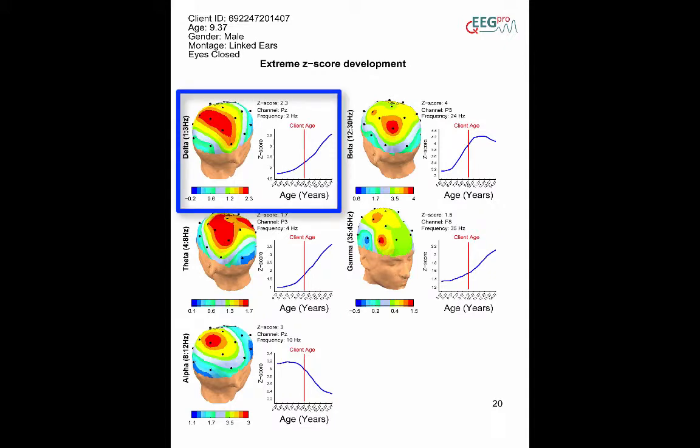Let's focus on the upper left corner of the example page. Here we see a three-dimensional plot which shows the most extreme z-score within the delta band. In this example, the most extreme z-score within the delta band is 2.3 at channel pz at 2 Hz.